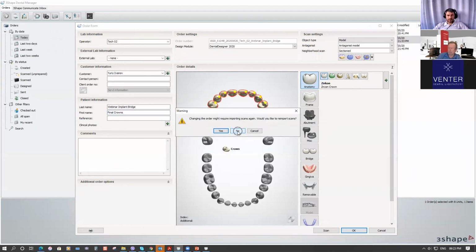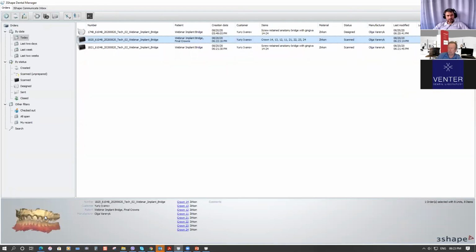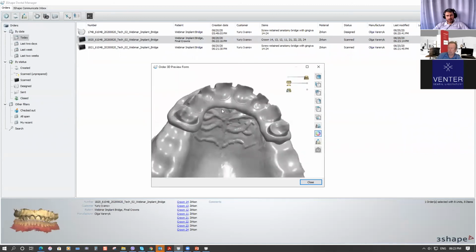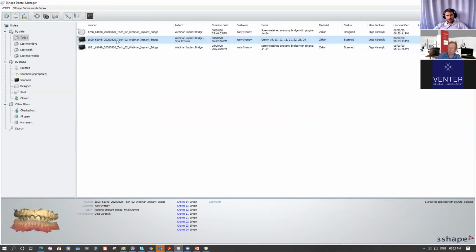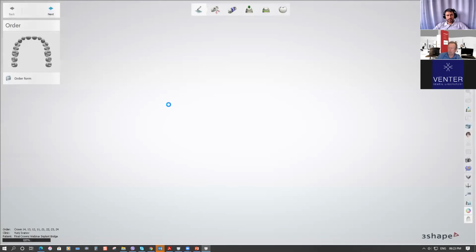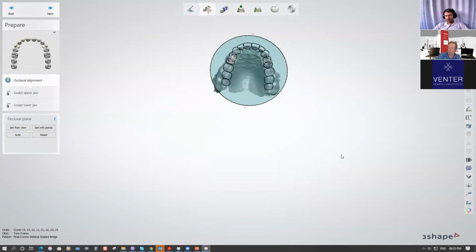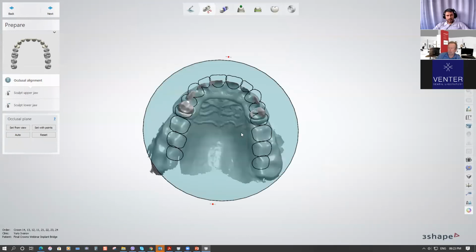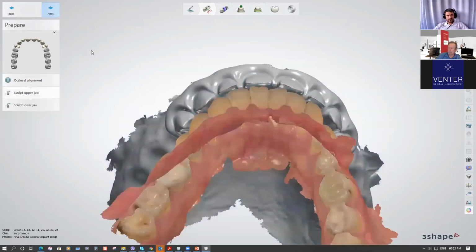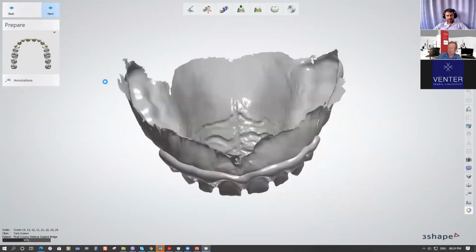And we don't want to re-import scans. It means we will use the same scans. And yeah, here we have our design as a scan over here. And I will double click to use this option. Yeah, let me take away face scan. Yeah, now you could see my virtual preparation here, and I'm just going next, next, next to Sculpt, to go to the segmentation and any other ways.